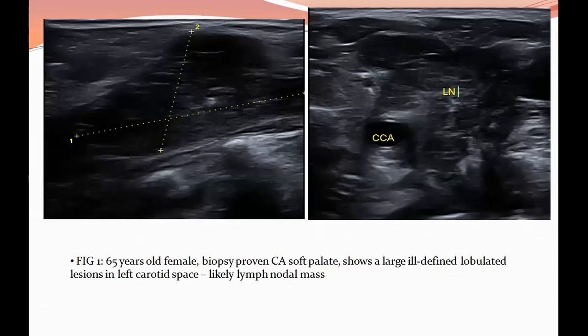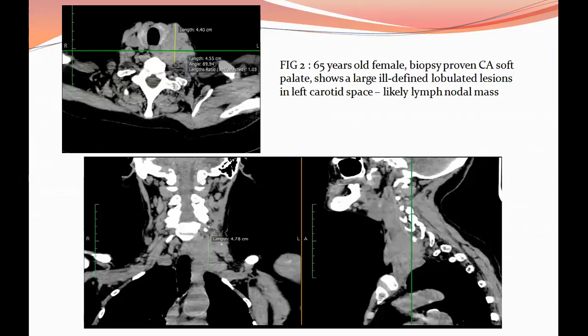This is a USG image of a 65-year-old female who had biopsy-proven carcinoma of the soft palate, showing a large ill-defined lobulated left carotid space lesion, likely a lymph nodal mass. The same patient underwent CT, and on CT we can see a large ill-defined lobulated lesion medially displacing the left common carotid artery and encasing it.